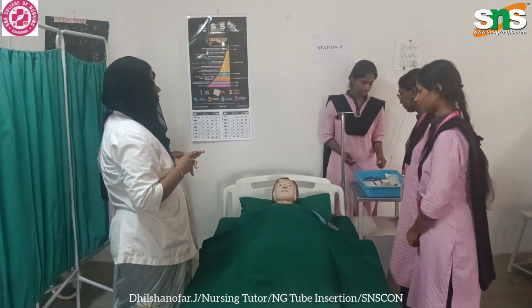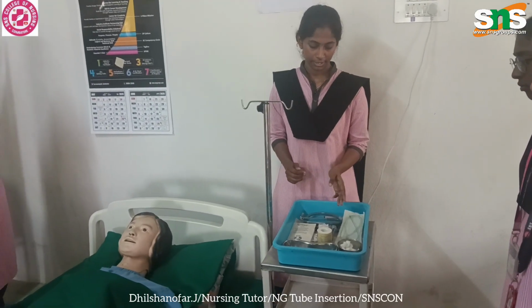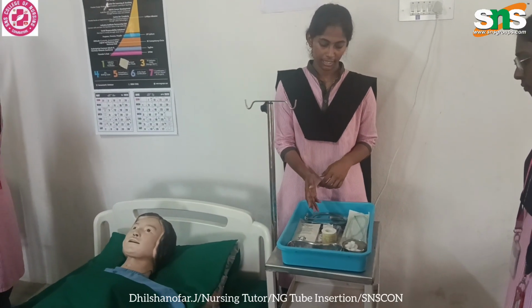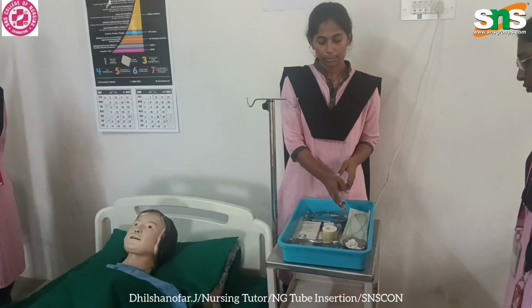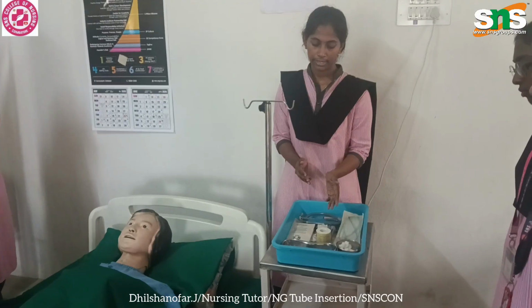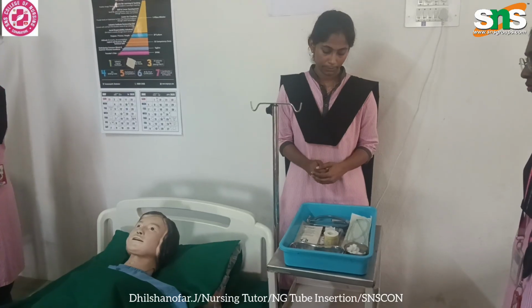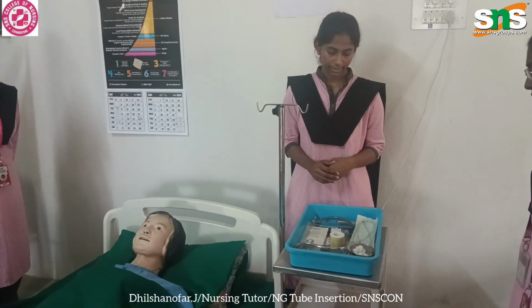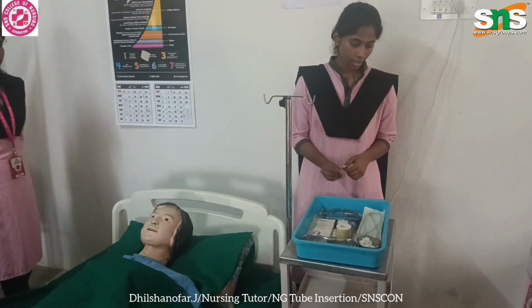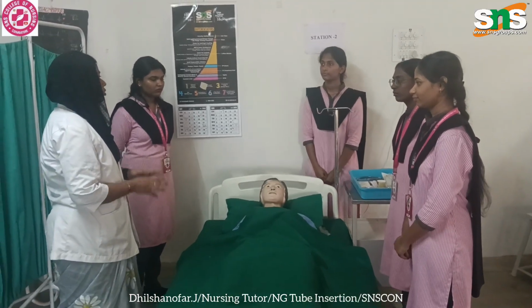Sterile tray containing naso-gastric tube for feeding, drainage and medication administration, 10 ml syringe for gastric tube aspiration, and lubricant jelly for reducing the discomfort, cotton balls to clean the nostrils, kidney tray for collecting the waste, adhesive tape to secure the tube, and disposable gloves to protect the patient and nurse from infection, stethoscope to auscultate and help check the tube placement, and a pen to mark the length of the tube.